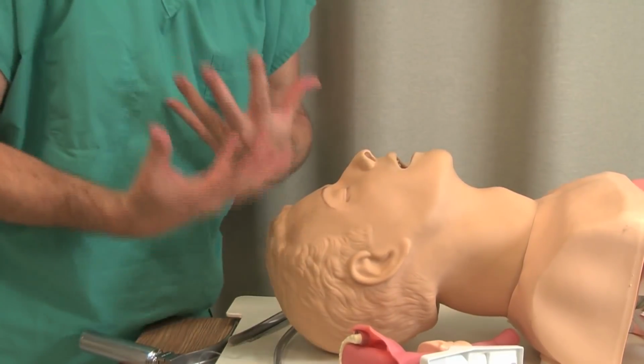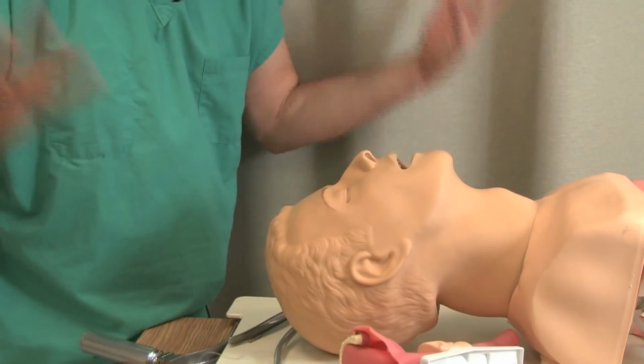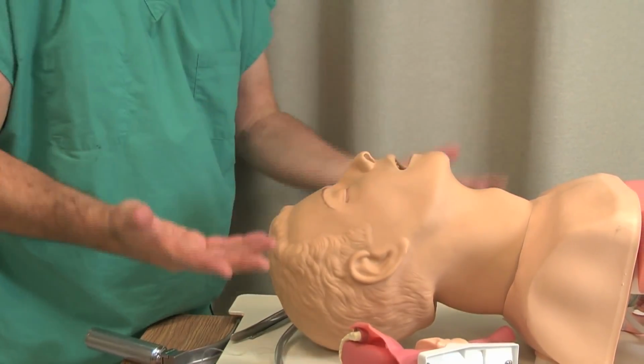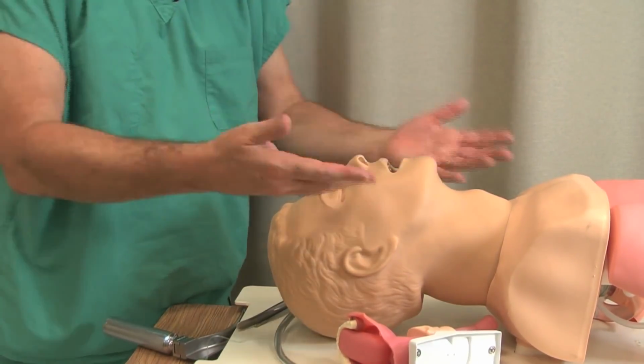Never be so proud to not ask for help. Ask for it. Look, I can't see it very well. I don't know how many times I've done it, someone else comes along, boom, they get the tube in right away. I would rather swallow my pride than hurt a patient.